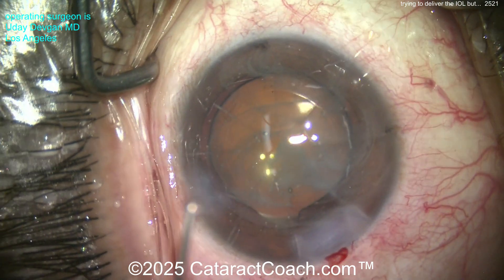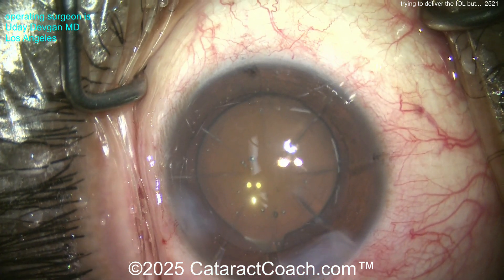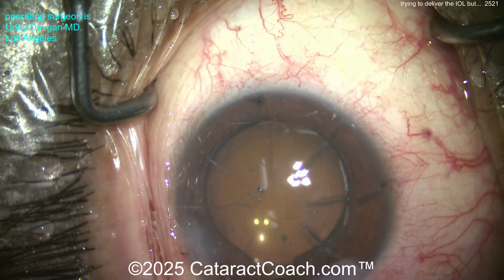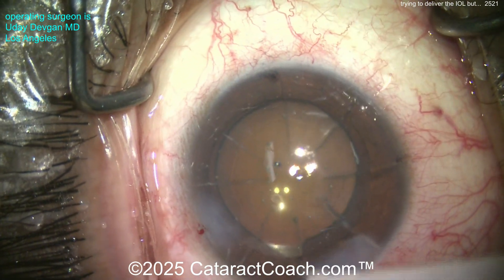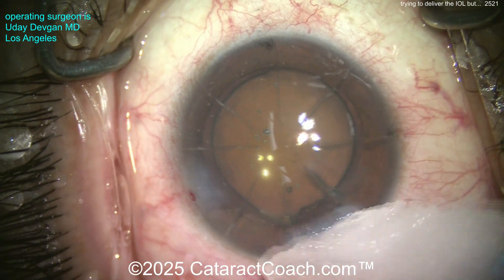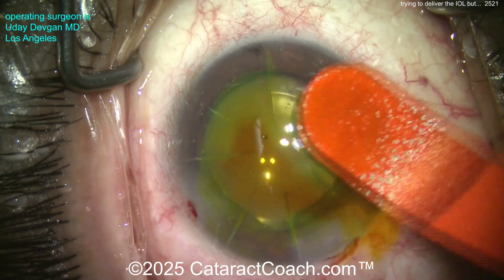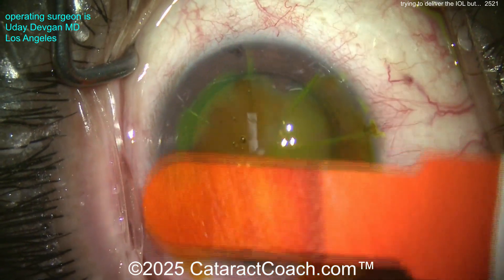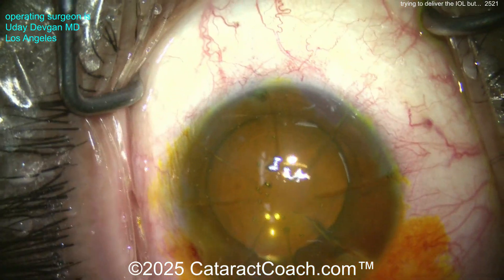Let's put some medicine in the eye — a little dilute preservative-free triamcinolone. If you don't know how to prepare that and remove the preservatives, go to cataractcoach.com and look it up. At the end, some antibiotic inside the eye, slight hydration of the incision just a little. Now let's get the fluorescein dye — check the incisions. Here comes the fluorescein dye, painted all over. Do we have any leakage? Nope, it looks great.